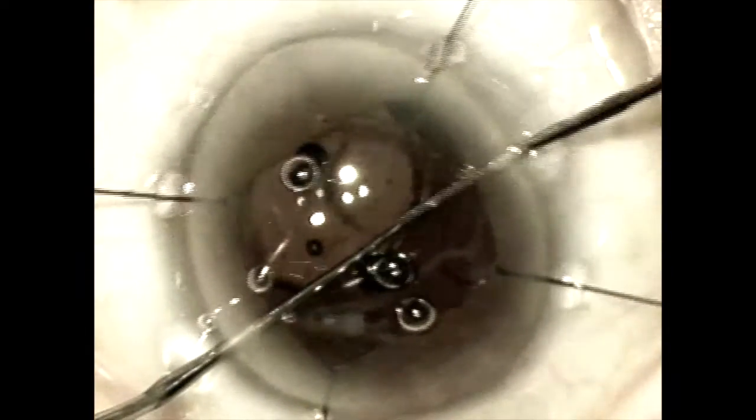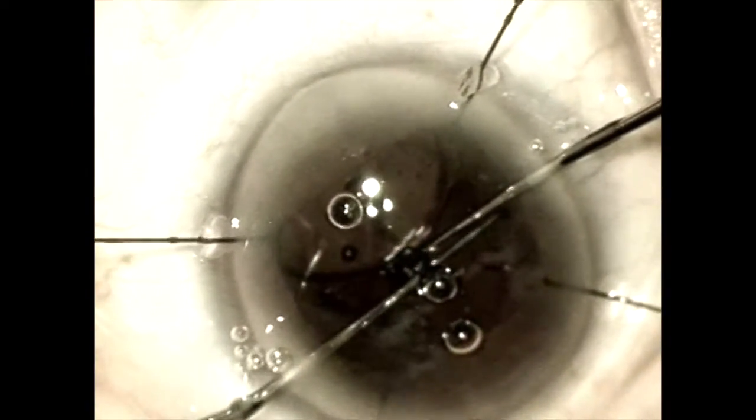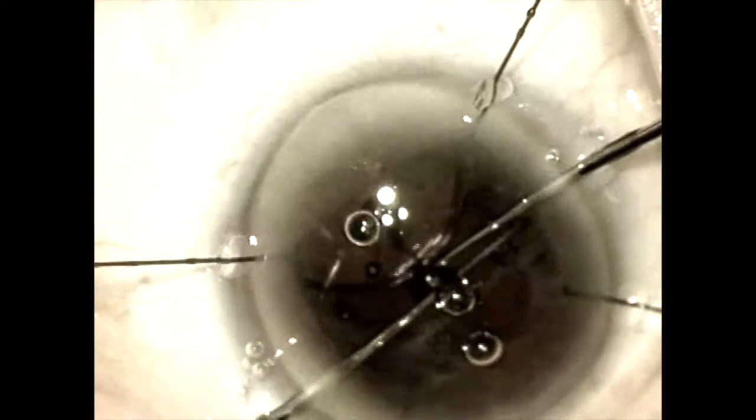We have placed iris retractors, dilated the capsular bag with viscoelastic, and now we are extricating the haptics from the capsular bag using micro hooks.